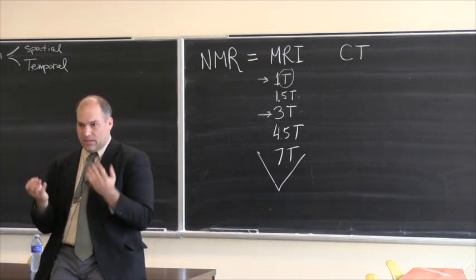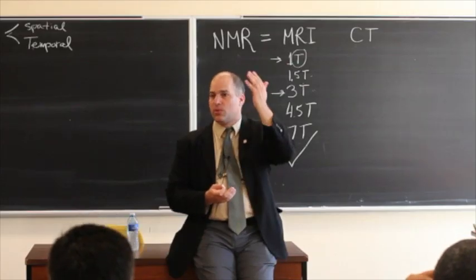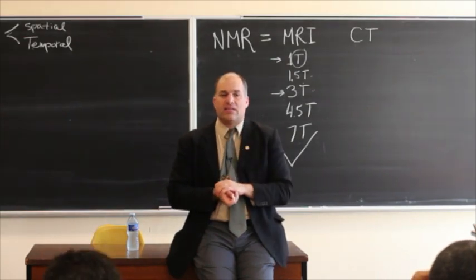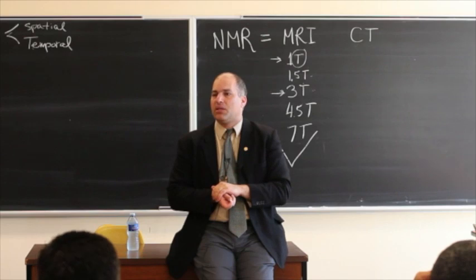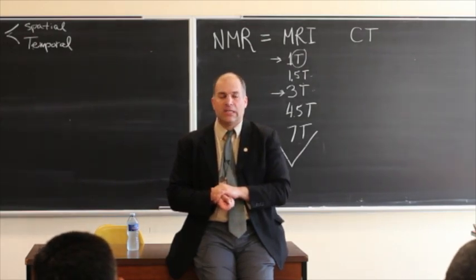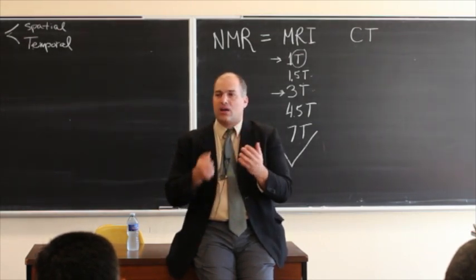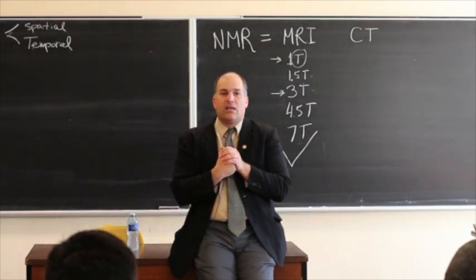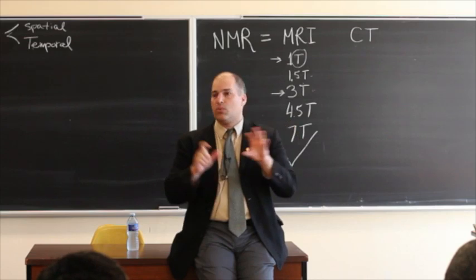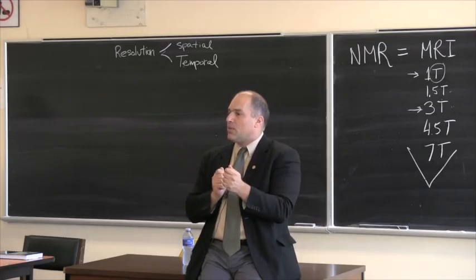MRI works, in a caricature fashion, in the following way. We have blood gushing through the brain. The brain is very rich in blood. Blood itself has magnetic properties because it contains a slight bit of iron and other things that are magnetizable. When you are breathing, you're taking oxygen in. That oxygen gets into the blood, and the magnetizability of the blood changes when it's oxygenated or less oxygenated. So as a function of how much oxygen there is in the blood, you get different magnetizability.